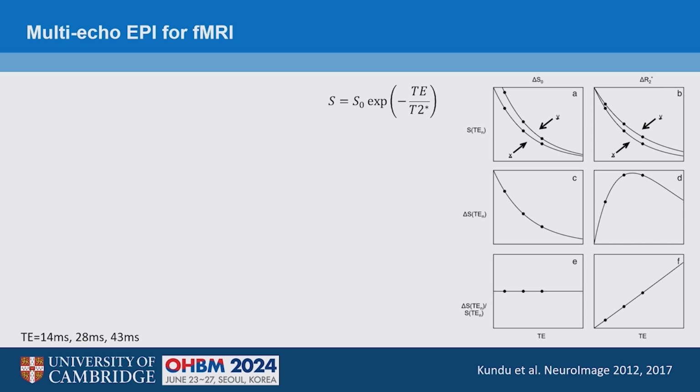It doesn't cost anything to do this approach, to acquire multi-echo fMRI, if your scanner's fast enough. Because it takes a little bit longer per slice, if your scanner can't handle the data rate, like mine, you have to have an upsetting TR. But for many people with good scanners, it's actually free to do this. So it's worthwhile acquiring the data.